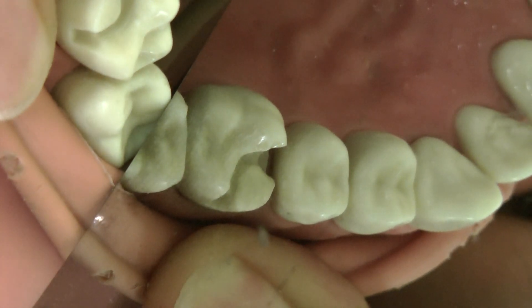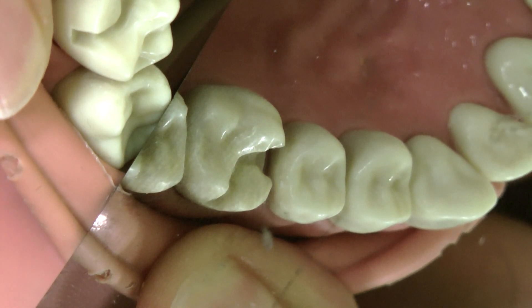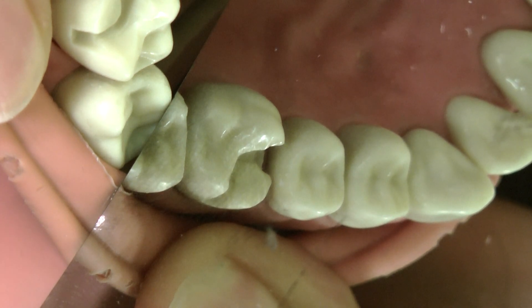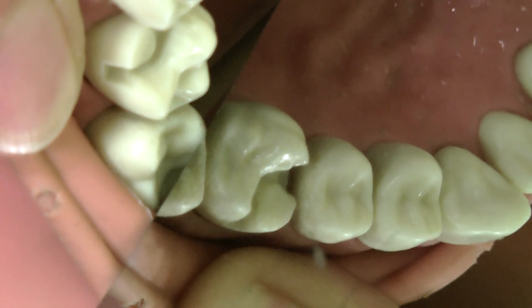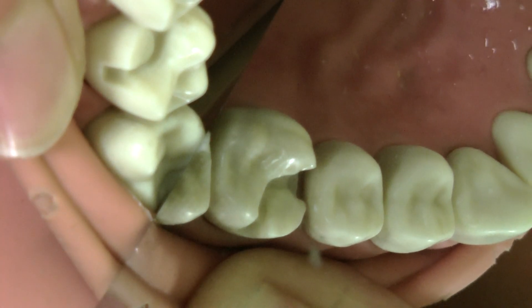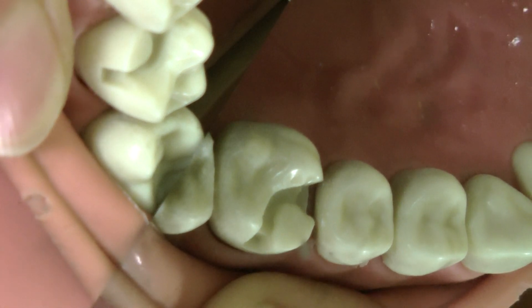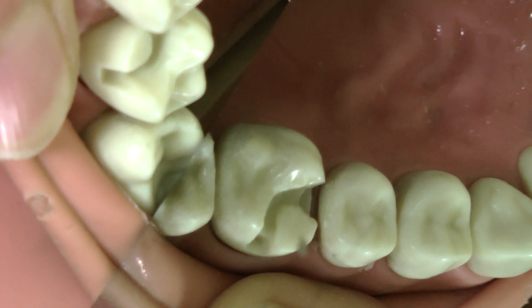This is a class two with buccal extension, with the mesio-buccal cusp broken almost in half. Like all composite work, what we need to do is remove the sharp edges if we have any, remove any undermined enamel, and then do a bevel all around the cavity before we start building up with composite.